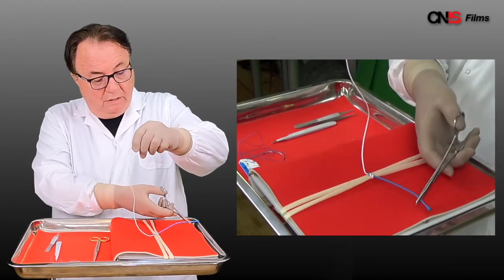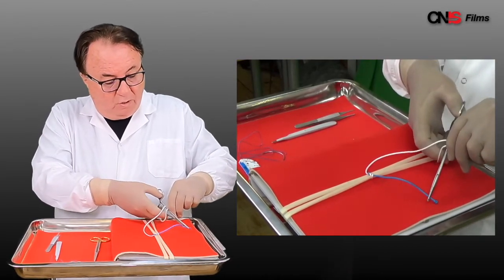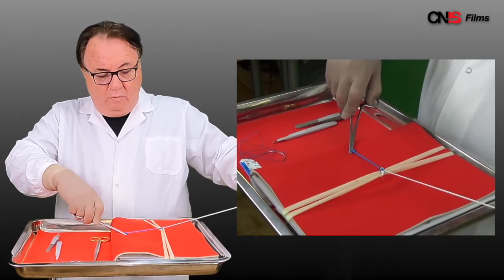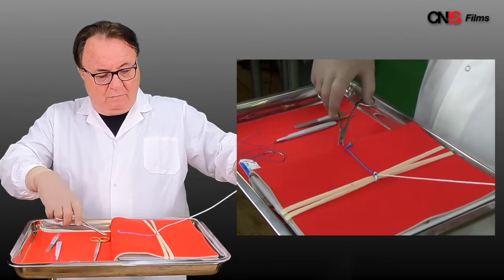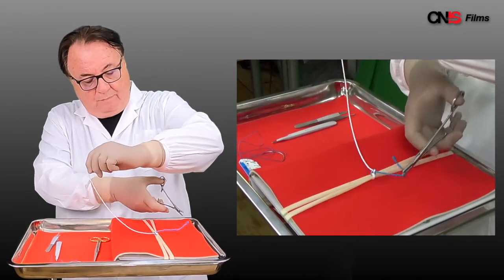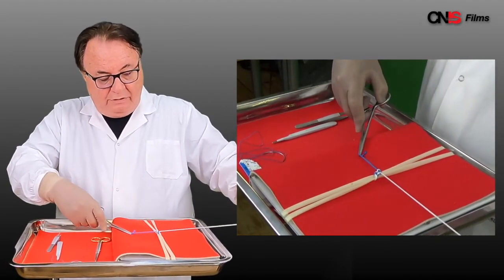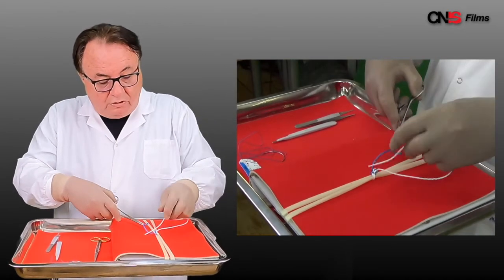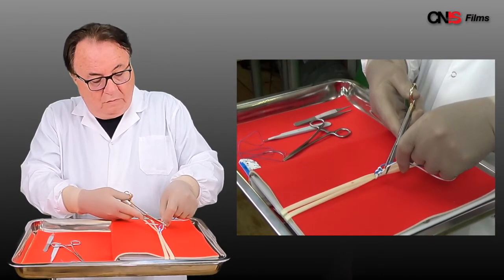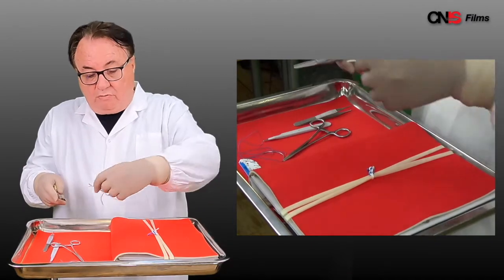We now have a new V. In the opposite direction, my instrument is inside the V. I do one throw, grasp the other limb, cross my hands and I now have a square knot — the knot you would have done as a Boy Scout or Girl Scout. You want to do it at least four times. Cross your hands, always inside the V. Do a wrap, cross your hands. That is a surgical knot. You can see every one of those is square. You then take your suture scissors and leave long ends so that it won't come untied. There is the demonstration with string of a surgical knot.